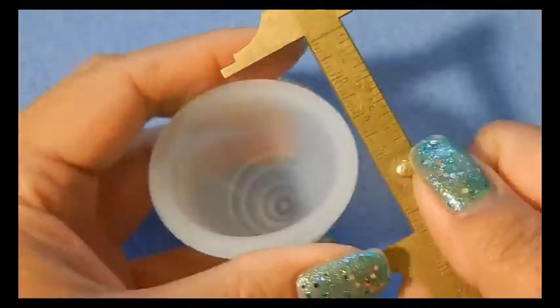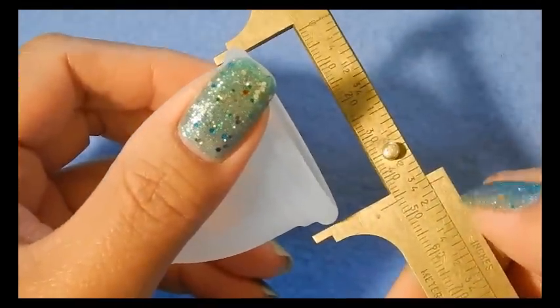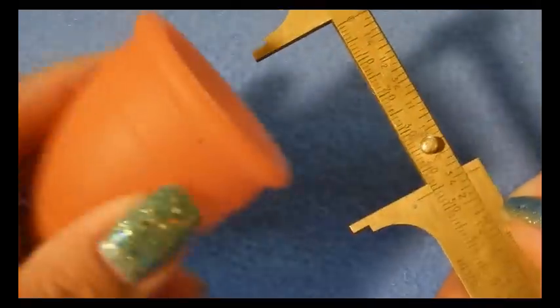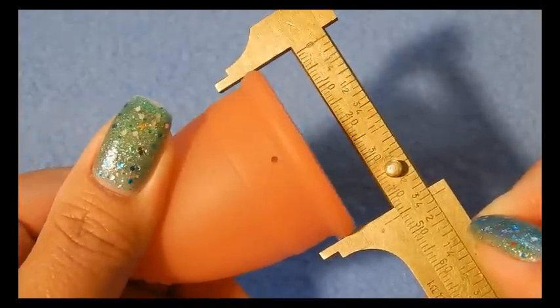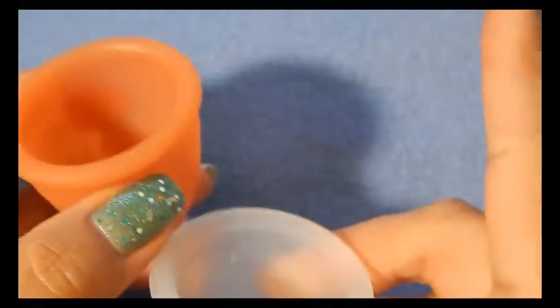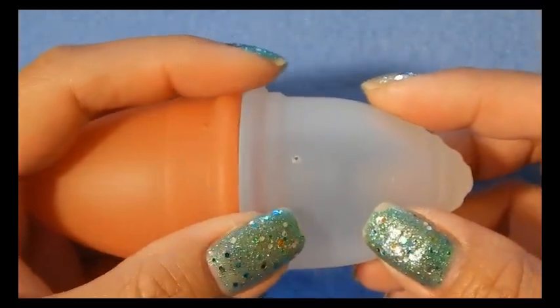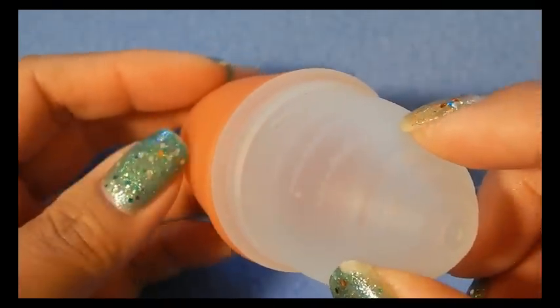The diameters around the rim are pretty similar. When I place them together, they do look a little different depending on alignment, but they are pretty similar in diameter.